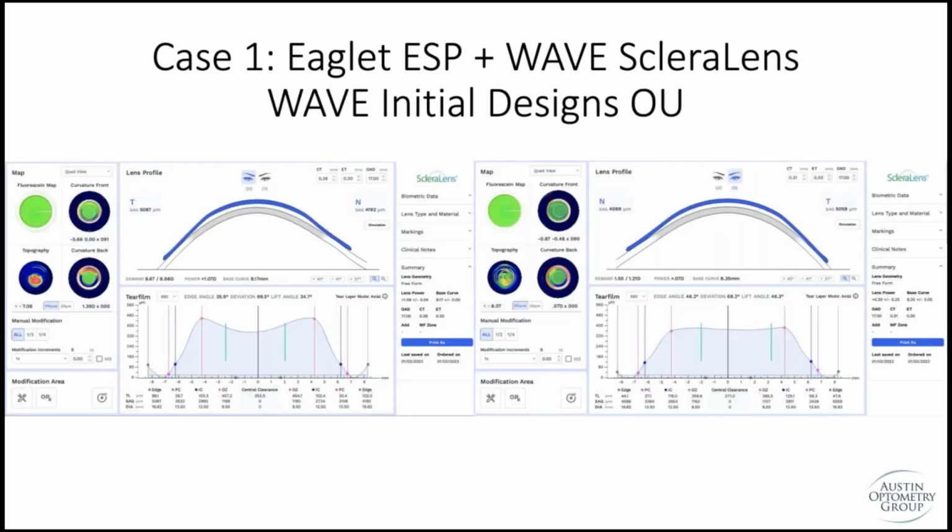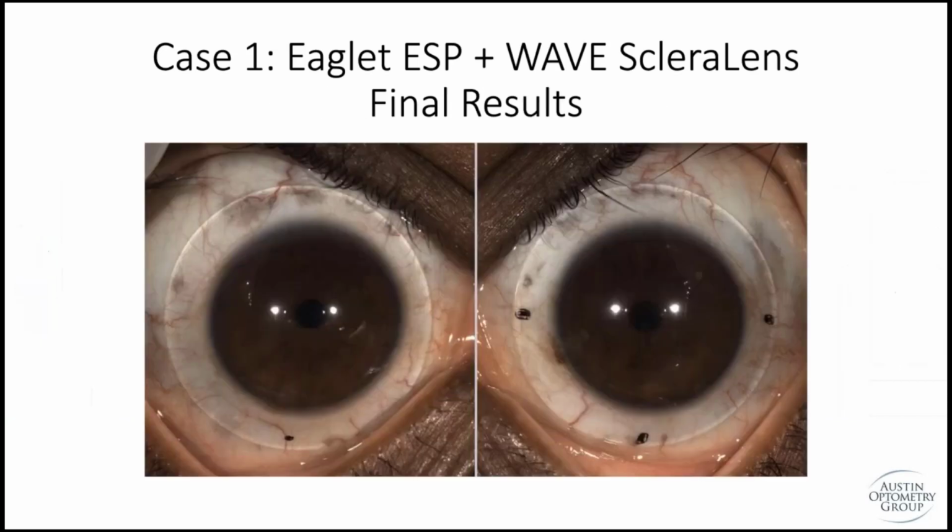You can adjust your preferences. I will have to reference what we did on this one. I think we did 4.5 millimeters past HVID, and this is how the lens came out. So first lens right off the bat, looking beautiful. Centration looks great. Again, because we have a good amount of sclera toricity, the centration, or the stability, looks good.